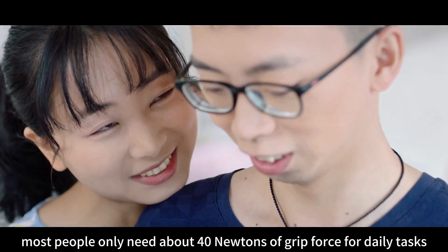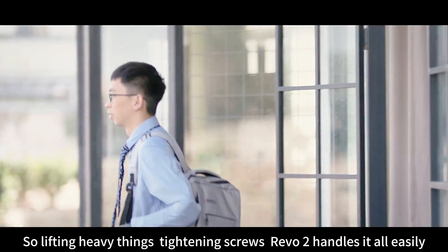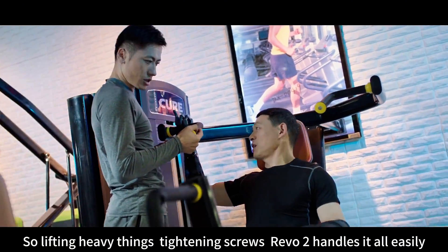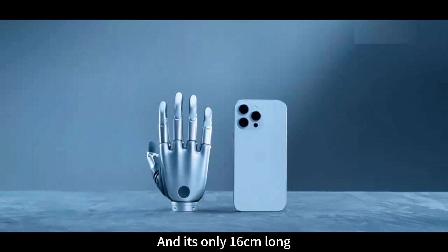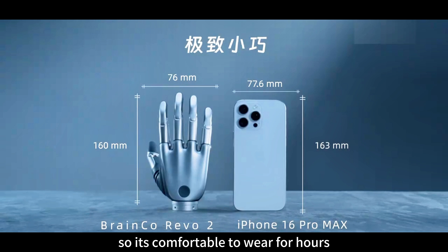For reference, most people only need about 40 Newtons of grip force for daily tasks. So lifting heavy things, tightening screws — Revo 2 handles it all easily. And it's only 16 centimeters long, about the size of an average woman's hand, so it's comfortable to wear for hours.